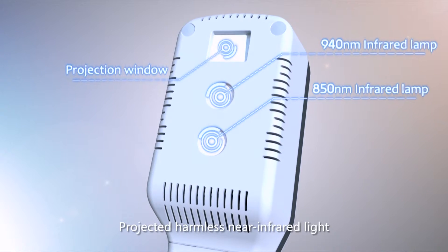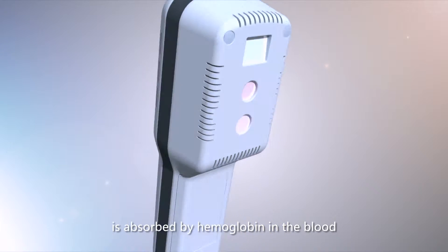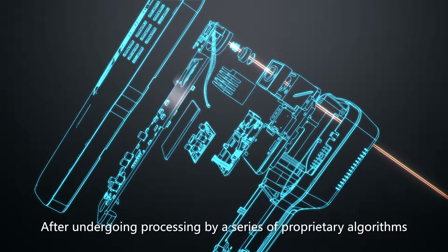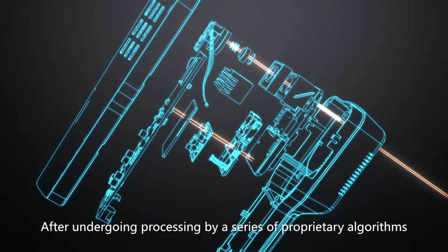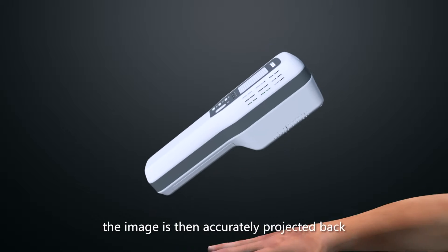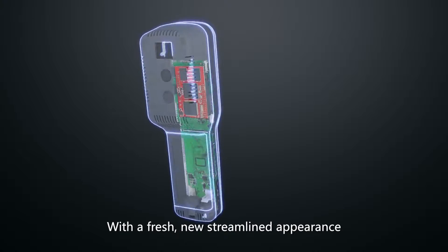Projected harmless near-infrared light is absorbed by hemoglobin in the blood and reflected by surrounding tissue. After undergoing processing by a series of proprietary algorithms, the image is then accurately projected back onto the patient's skin in real time.